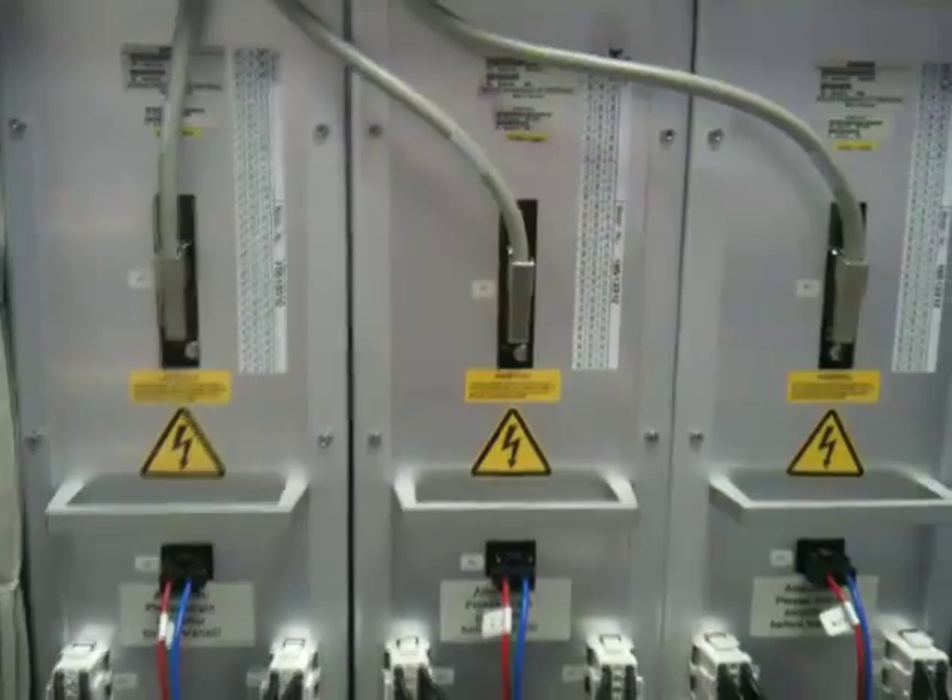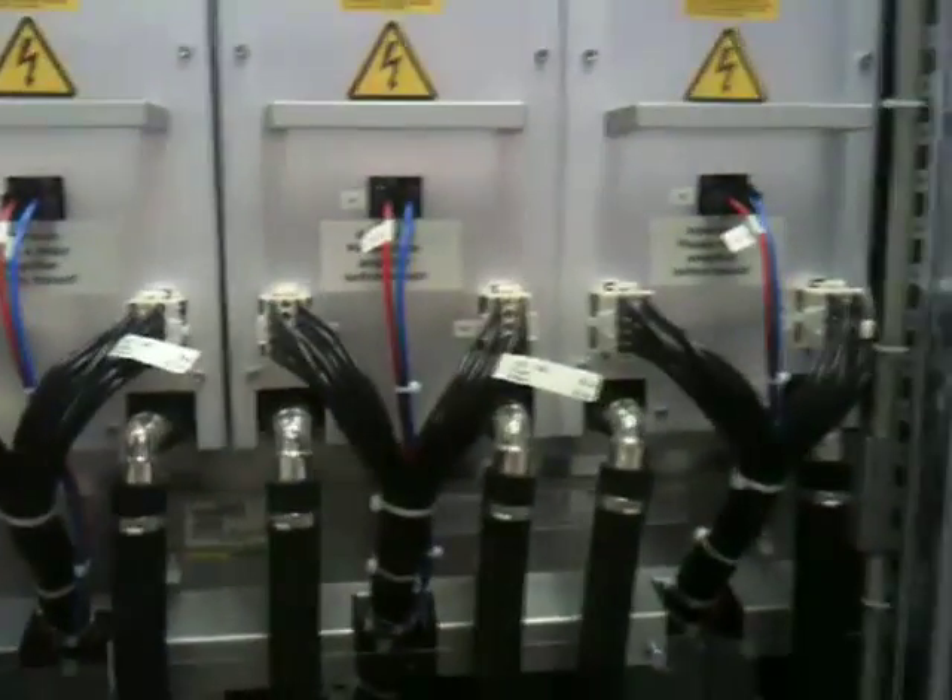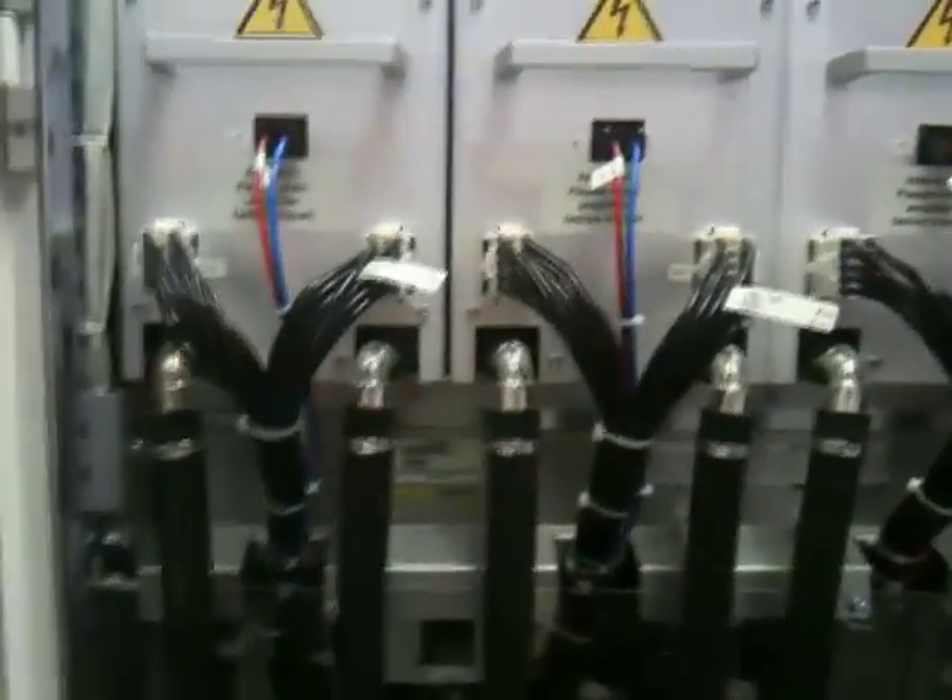These are the gradient amplifiers — we've got three of those, one for the X, Y, and Z directions. Big amplifiers with signal in red and blue, signal out via black wires, and you can see about 12 cores per cable.